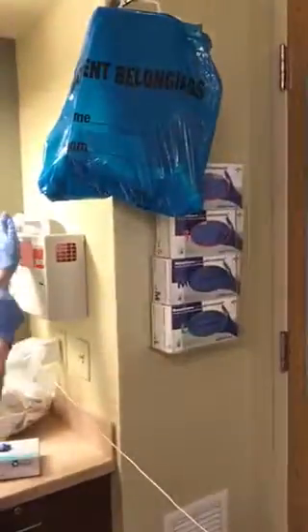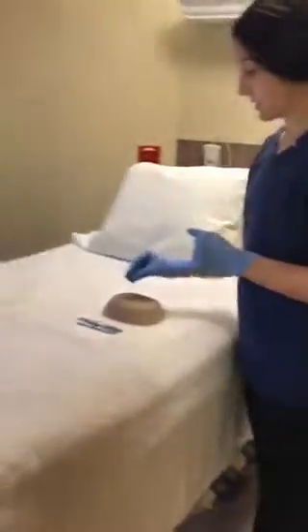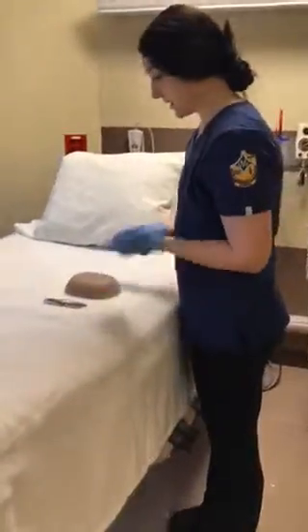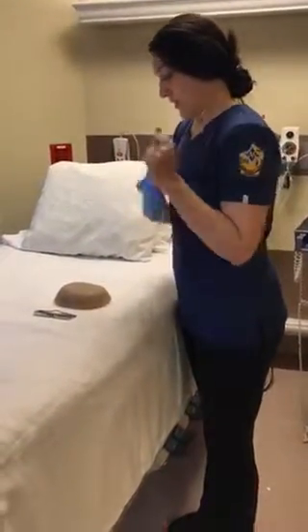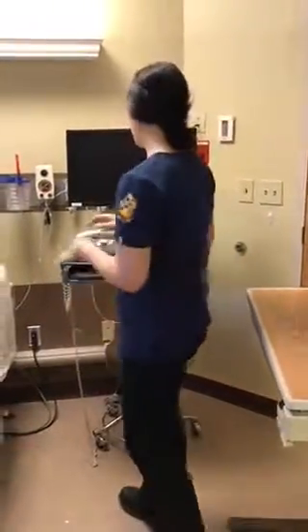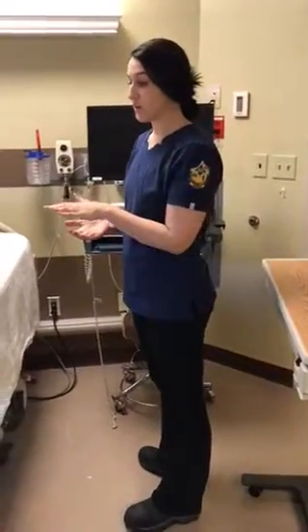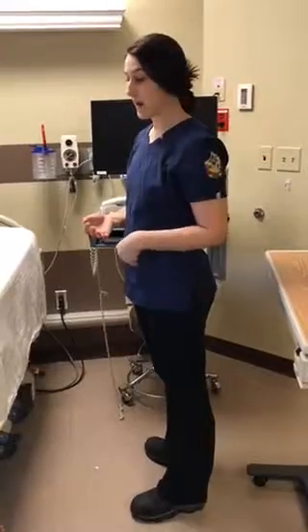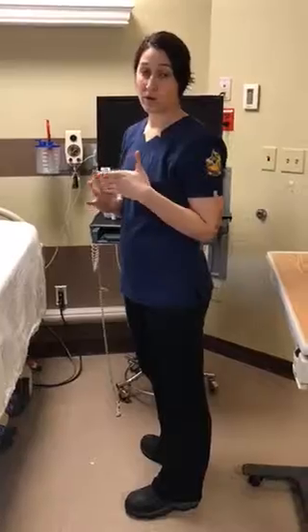I'm going to dispose of my needle in the sharps container. And if Bob was bleeding, I would take some gauze and dab that. But he's not, and everything looked good. Bob, how do you feel? Okay. And that went okay for you? Yeah. All right. So the final thing that I'm going to do is go to my MAR and document the patient's response. I'm going to document that we injected that insulin in the left lower abdomen and that we administered 10 units of U100 Humulin R.